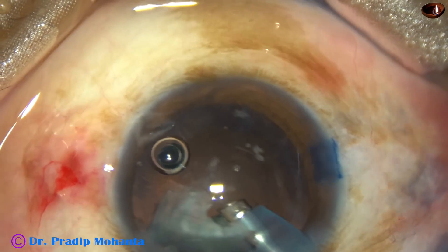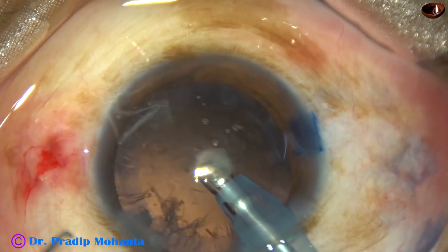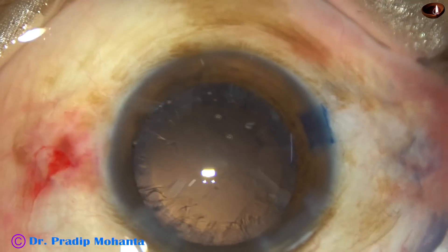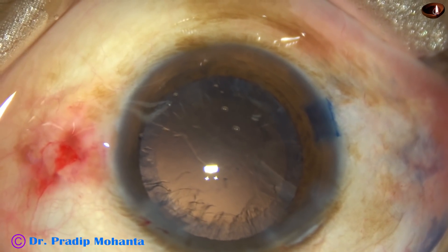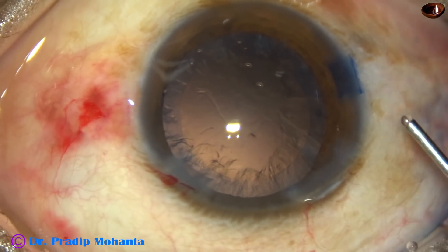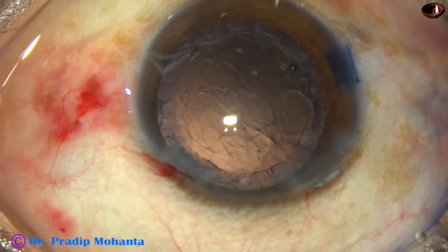At this time, bevel is up and I am emulsifying the last nuclear fragment. The phaco power used in this case is 60%, flow rate is 45 ml per minute, and vacuum is 450 millimeters of mercury.